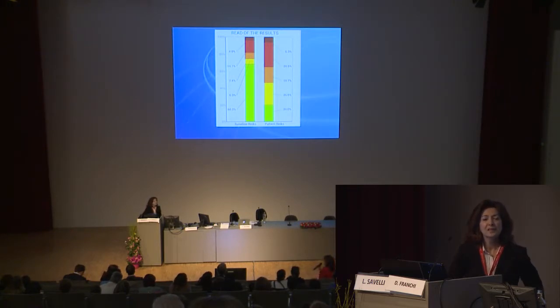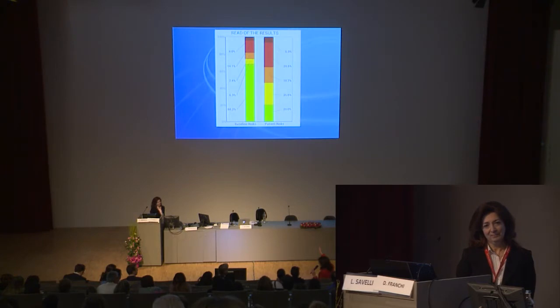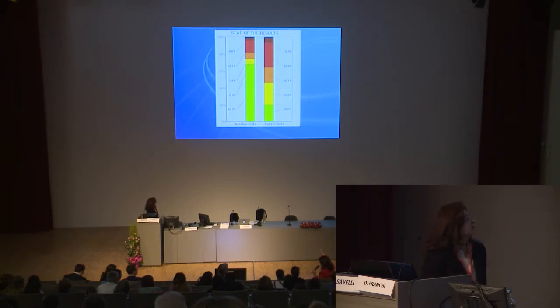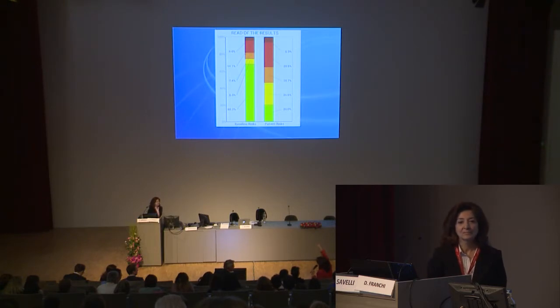May I ask Professor Vergote, for the clinician, we are ultrasound examiners, for the oncology surgeons, do you think it is better to provide these two columns, I mean the pre-risk and the post-risk after ultrasound scan, or is it better or sufficient to provide the diagram Luca showed only with the risk? Because to me, for the surgeon, it's not so easy when we provide only the distribution.